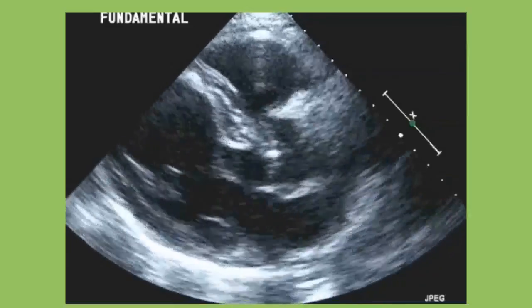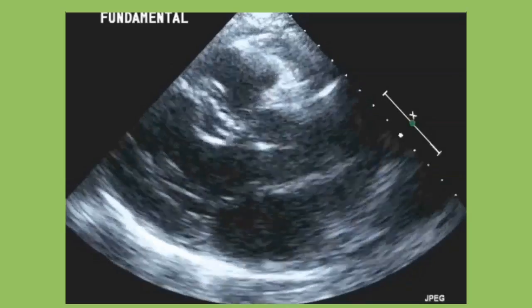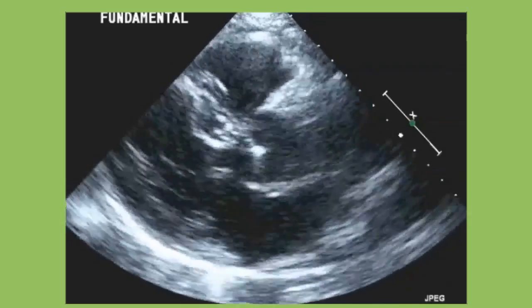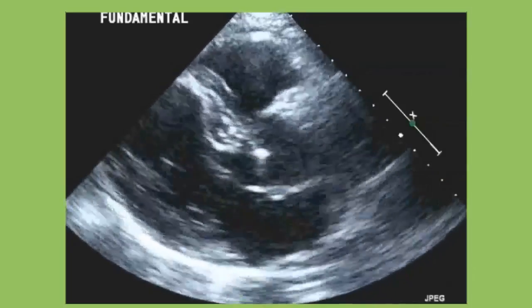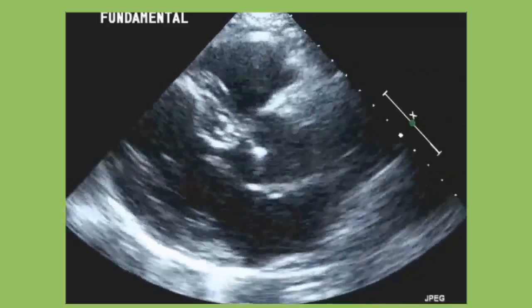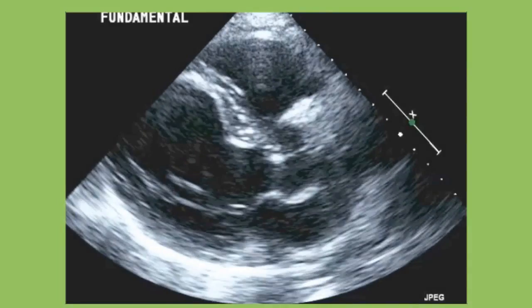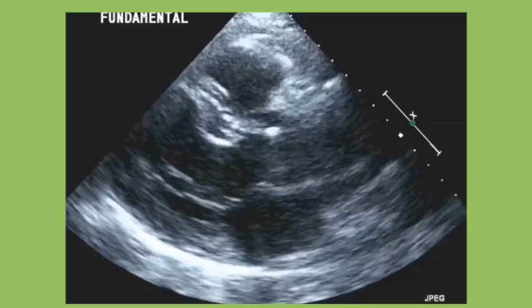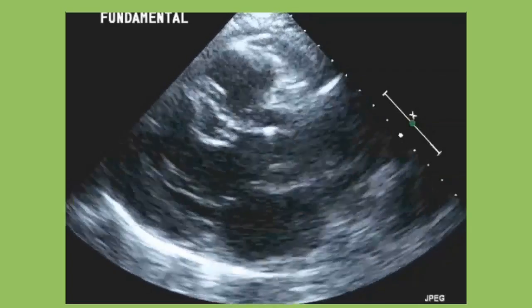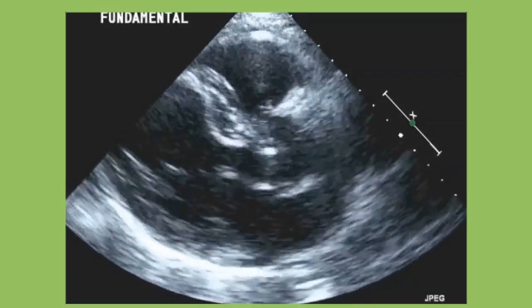This is a patient that had an infarct of the mid-left anterior descending artery, and despite the fact that that segment is completely akinetic, there's no flexing of the muscle, just like in the example of the bikes in the previous two slides, that segment is moving, as you can see. And it's moving not because the segment is doing anything, it's not because there's any deformation, but because obviously it's attached to the proximal segment of that anterior septum, and that segment is tethering this akinetic mid-anterior septum, giving me the impression that it is moving, when in reality there's no deformation, it's just movement out of the tethering.